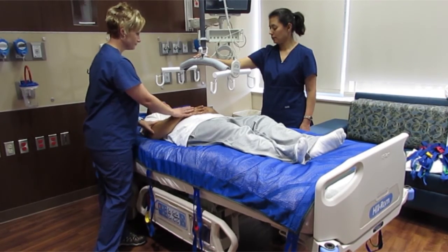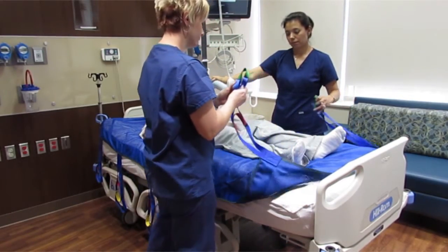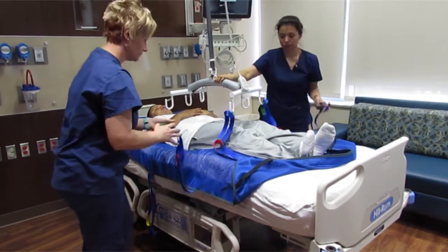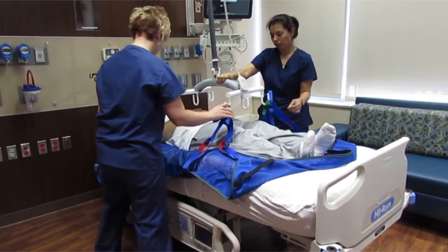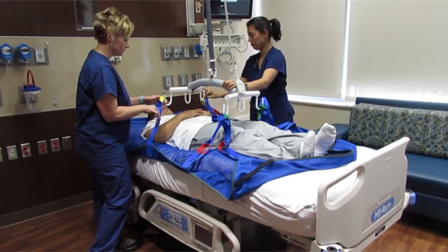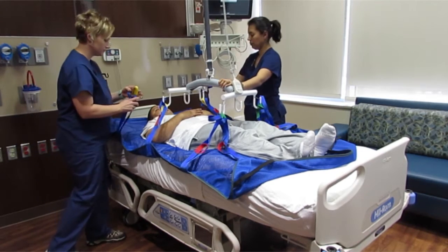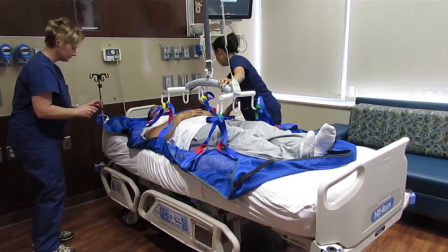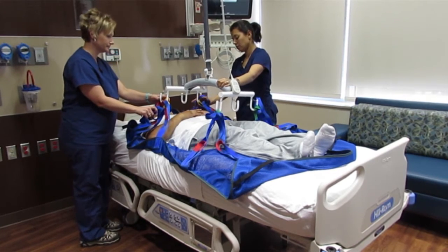Now you are ready to hook up the sling to the spreader bar. Always start at the foot of the sling when hooking it up. Hook the green colored loops to the foot end of the spreader bar hooks, then hook the yellow loops to the head end of the spreader bar hooks as shown. Then hook the red loop of the last strap at the head to the same hook as the yellow ones. Now you can see how the red-light colored loops are used.